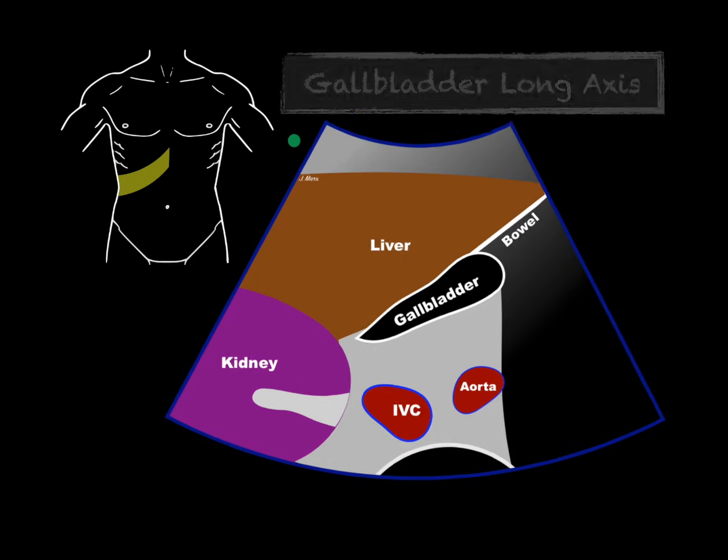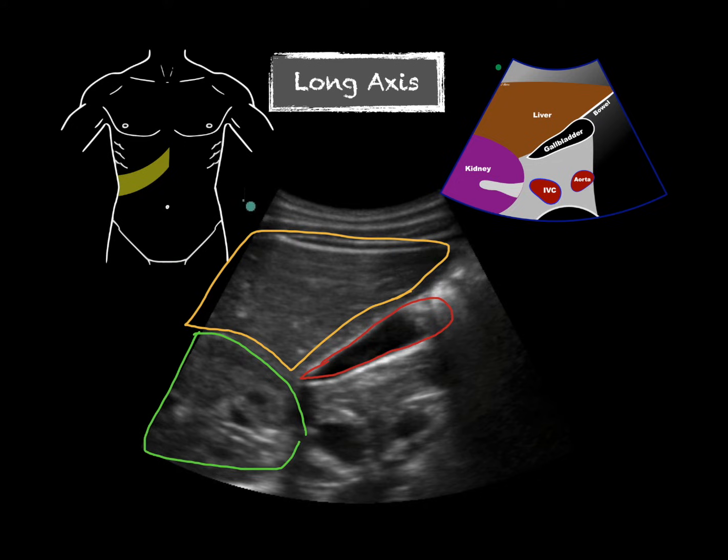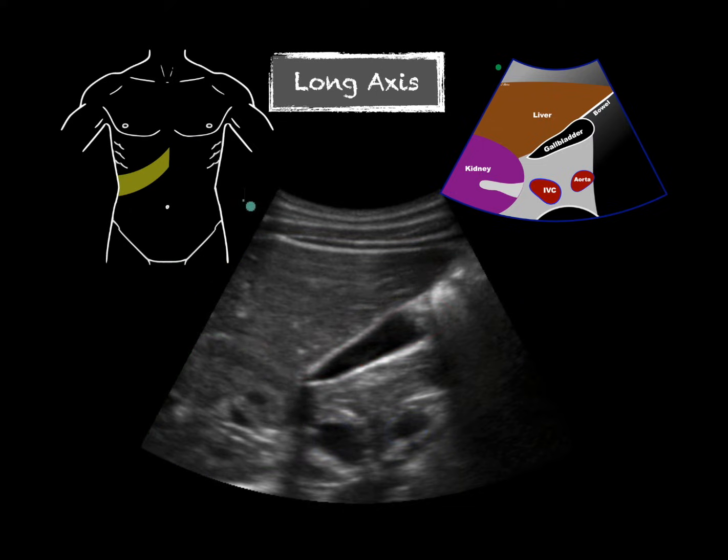So what we're going to see here is our gallbladder here in red. Go with yellow. Here's our liver. We can identify that structure up there. We do see in this image, you don't often see it, I'm going to do it in green, is the kidney. And it's right there. And then we have some vessels. Let's do those in blue. Right here and right there. That's going to be your IVC and aorta. Now, like I said, this is not what you're going to see every time. This just happened to be in this image, and I did a drawing of that to show you one example.